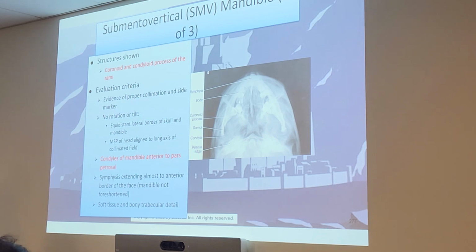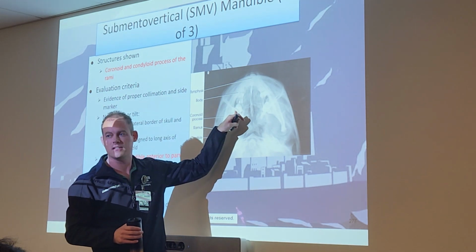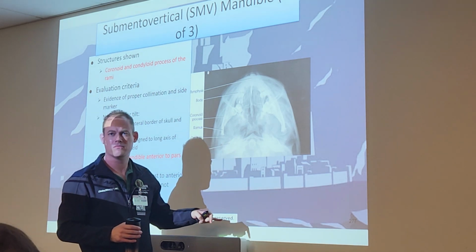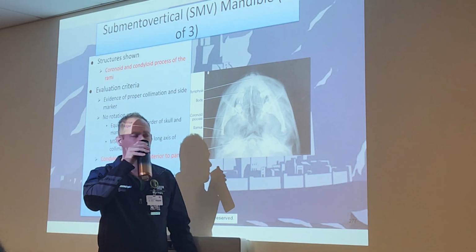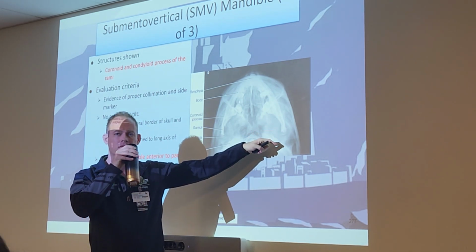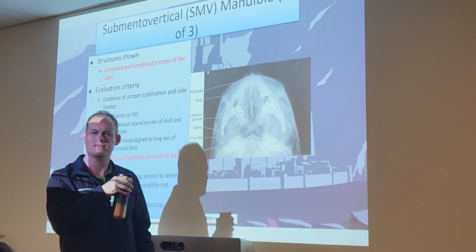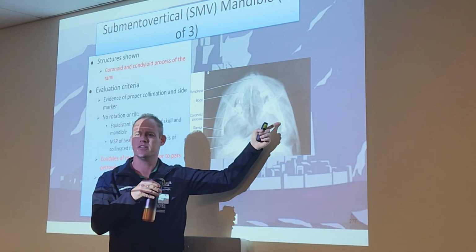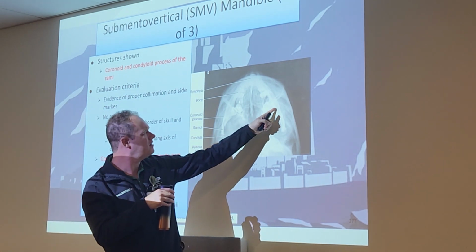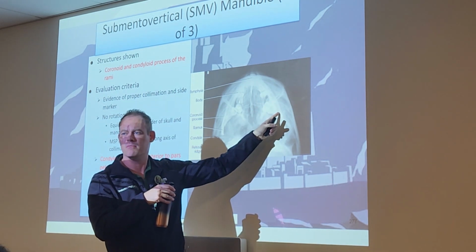Are those teeth on the medial side of the ramus? Yeah, more towards the actual mandible. It looks like a triangle, sort of. How about this right here? That's the coronoid. Beside this portion here, there's this dense area. I think that's just the mandible superposed on itself, the rami and the body. Just next to where your finger was. Here? That's a tooth, yeah. Okay, so that white portion there is the superimposed body and rami.